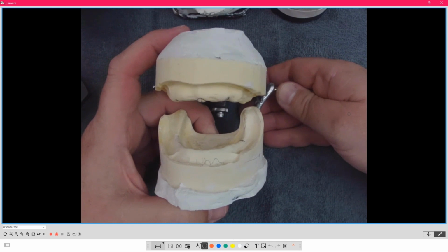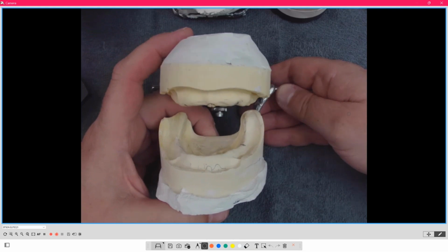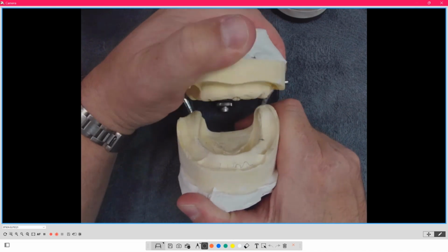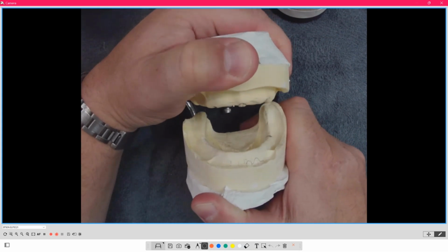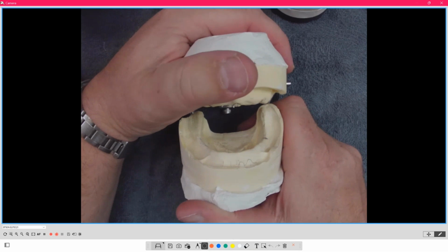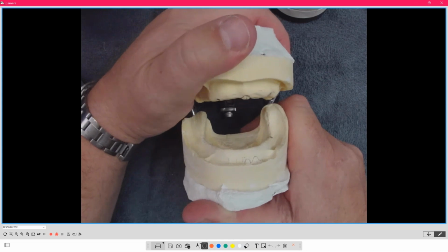I don't do this anymore, because even from the quick video that I showed you of my one patient, they don't function like this. I actually pick the articulator and I emulate a chew cycle. I can do that on just a simple crescent articulator, moving it how she was doing it. I've learned to move this articulator differently, in the patient's best interests. You can do that with these crescent articulators, or I have a Cavo one, a Protar.